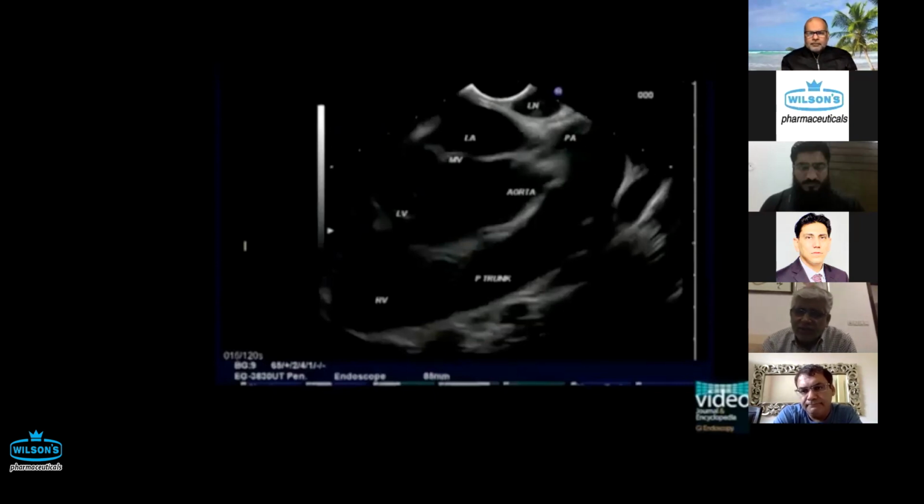But by and large, I think it's not difficult at all, because the lymph nodes are right next to you. It's a straight tube, not generally angled so much. So like you said, it's probably the best to learn, and in terms of safety, I think it's also safe to start with. This is what I think.